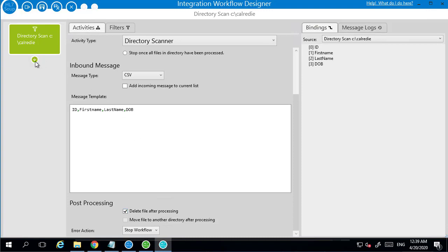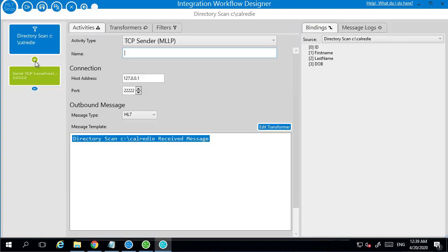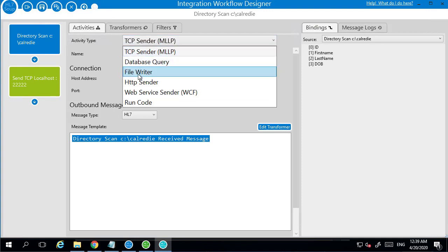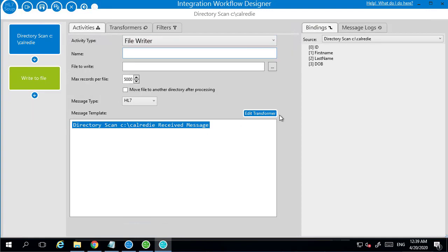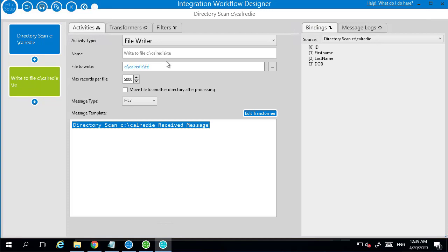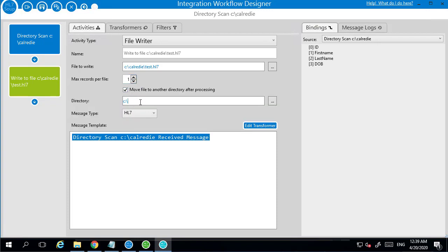As a second step, we are going to add a file writer in. We're going to write it back into C CalReady, call it test.hl7. We'll change it to one record per file and we're just going to move it to another directory after we've processed it. We'll stick with this C CalReady but we'll call this process.